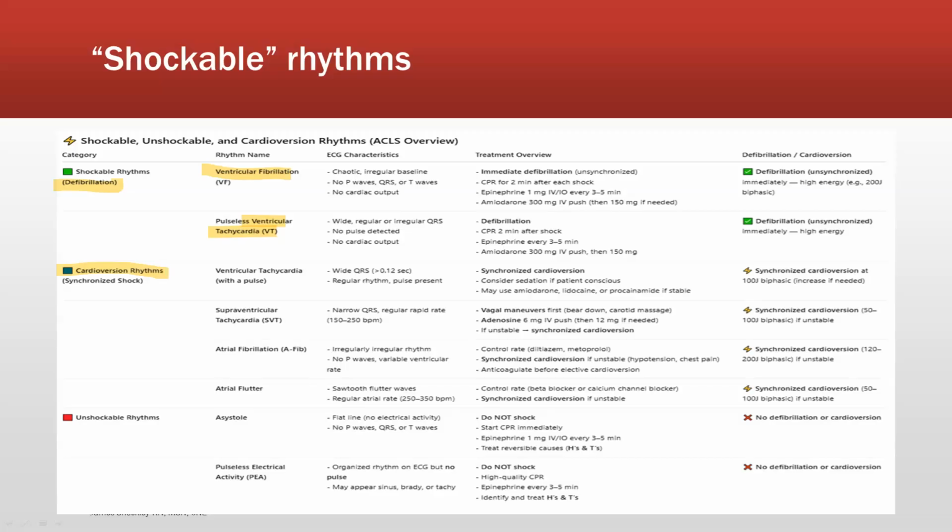For your cardioverted rhythms, what we're going to see is stable VTach, SVT, so supraventricular tachycardia, AFib, and A-flutter. What I notice mostly here is that 3 of the 4 of these rhythms are in the atria. And I know it's a cardioversion because cardioversion uses less electricity, and with all due respect to your atria, they are less than the ventricles.